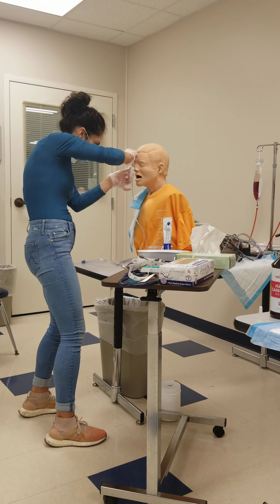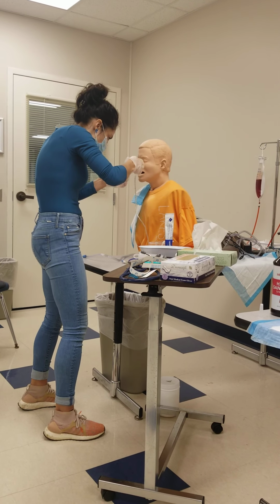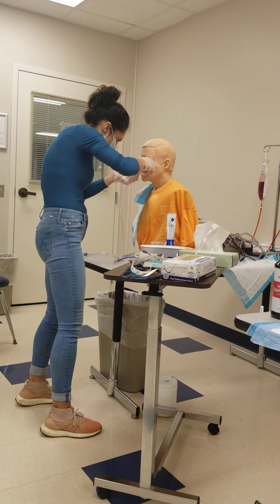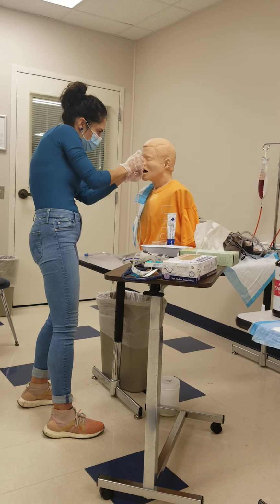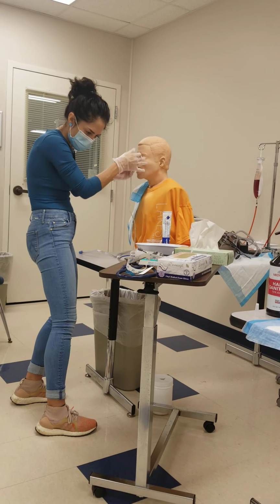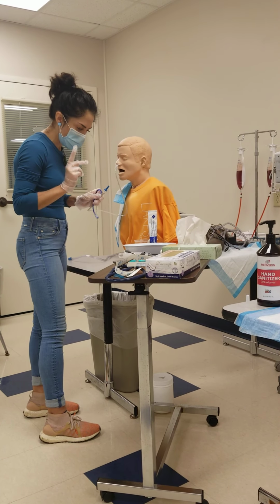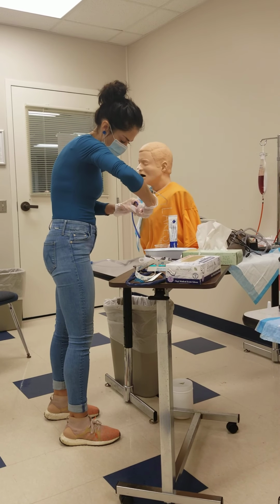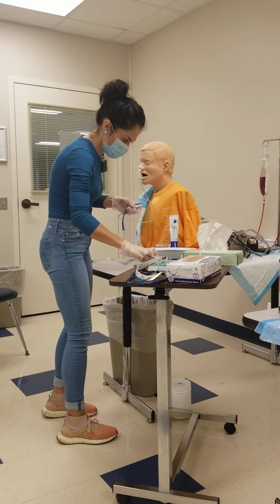All right. So that goes right down the patient's nose. And then the other two little pieces are just wrapped around the tube. Okay. All right. And then what I want to do next, so I need to confirm placement. Okay. So, I'm going to take the cap off.